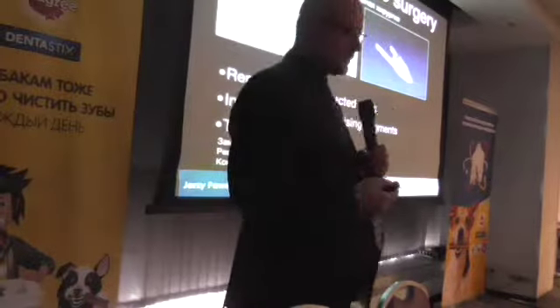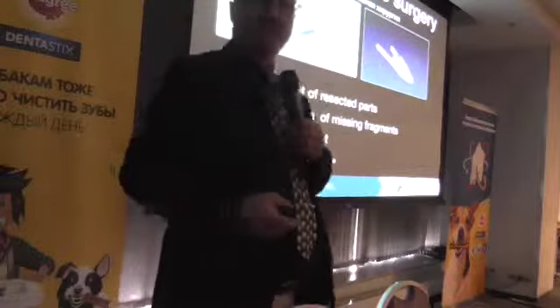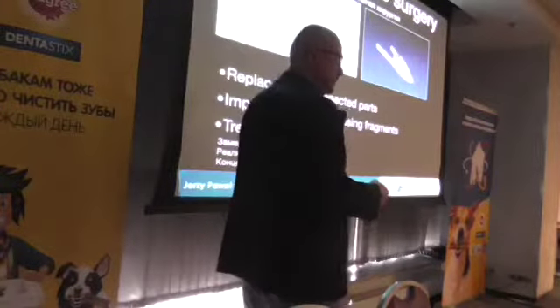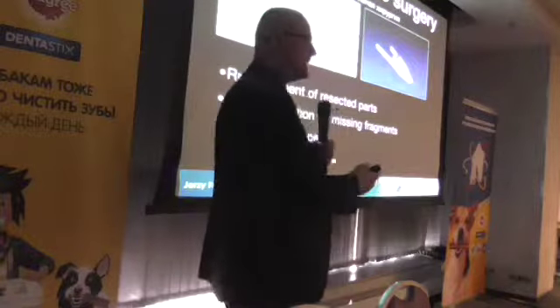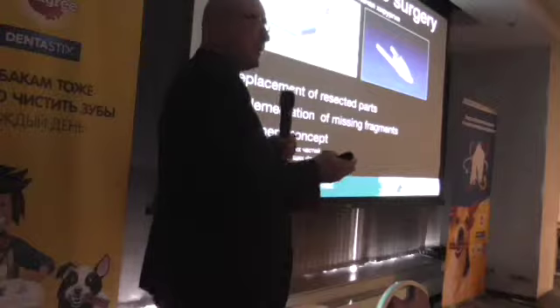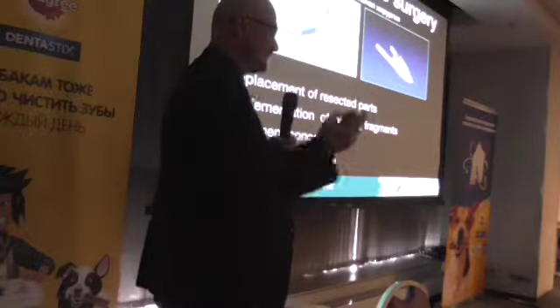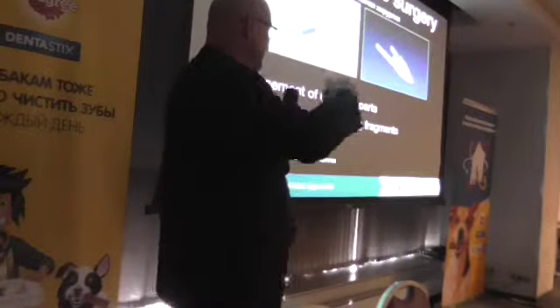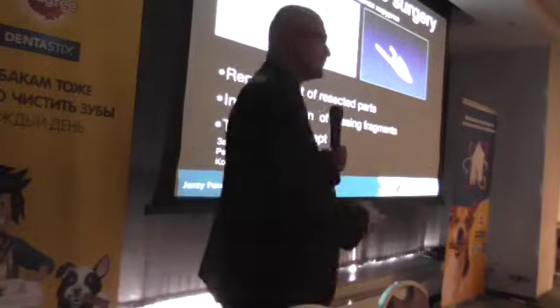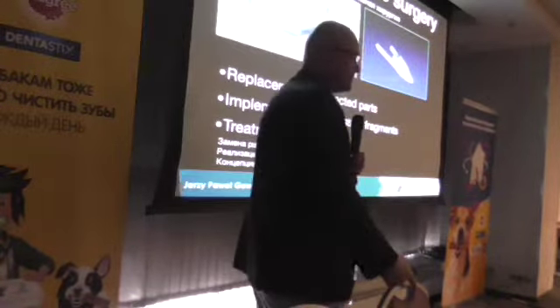So that's on the left. You see that this is the design of a replacement, and it was printed of titanium, and we implemented that. It is tailored exactly, so it's really like a small puzzle. You place it in there, and it fits perfectly. So it's really wonderful. It's expensive though.